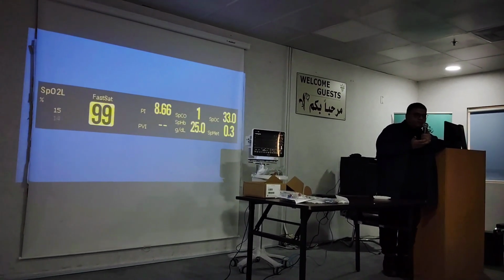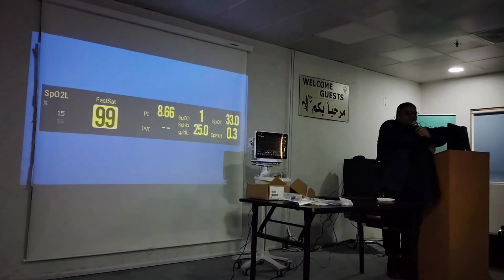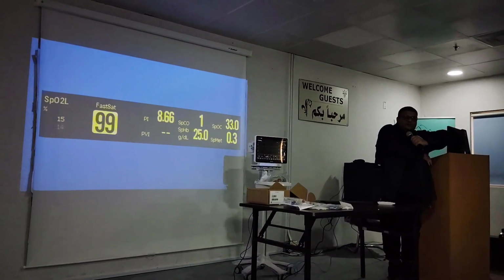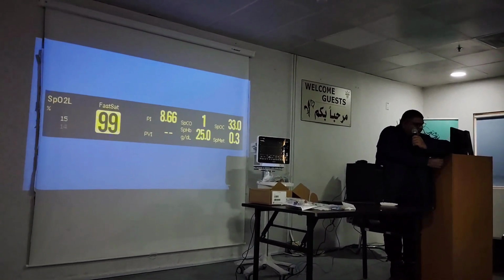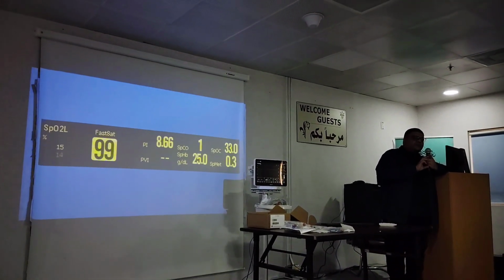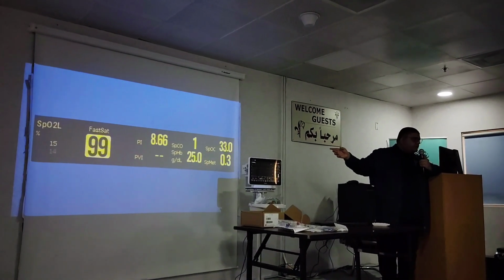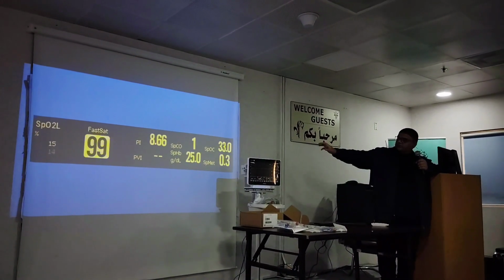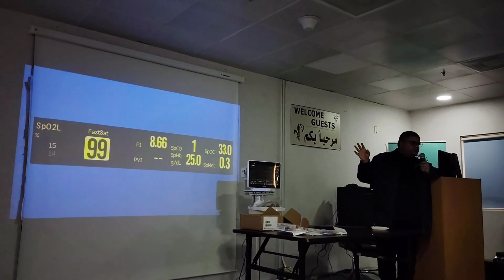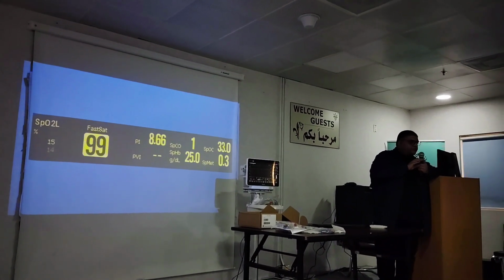The value should not be accurate. Maybe you pressed it too hard, or the patient is using a pillow under their arm. You know, when you use a pillow under the arm, it occludes your brachial artery. So the supply of blood to your finger will decrease, so the perfusion value will decrease because of that. So the perfusion value is kind of like a signal to tell you whether the patient has enough perfusion in this area to be monitored for SpO2.